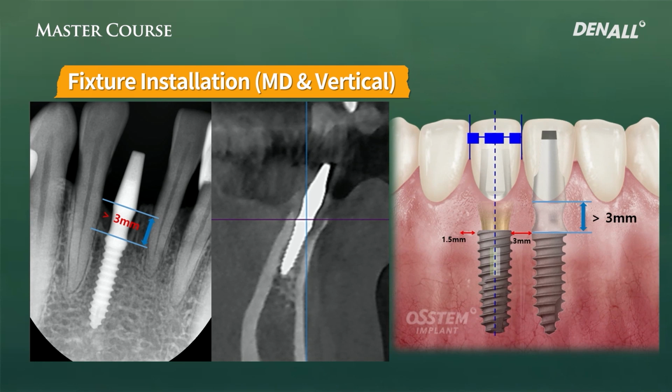I believe the implant's biologic width would influence the long-term stability more than anything else, so it should be respected. So the implant collar, the vertical position, should be at least 3 millimeters. So the implant collar part should be within the gingiva, should not be exposed.